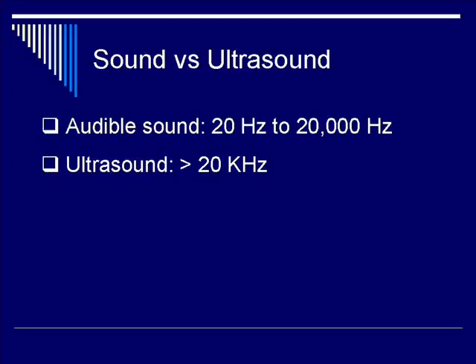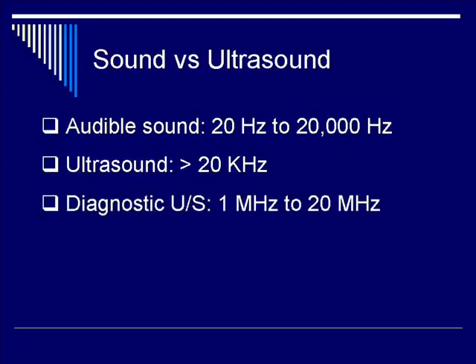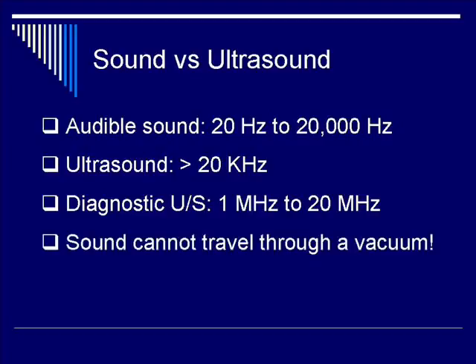However, during the Doppler measurement employed during a vascular study, for example, oftentimes we can hear audible sounds because the Doppler frequency falls within the audible range. Diagnostic ultrasound consists of probes that have frequency ranging from 1 MHz all the way up to 20 MHz. Abdominal probes typically have lower frequency range, whereas vascular probes can be upwards of over 10 MHz or more.